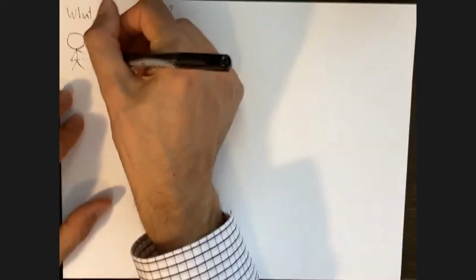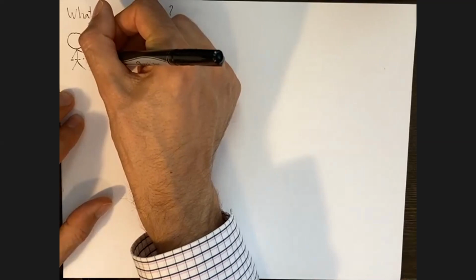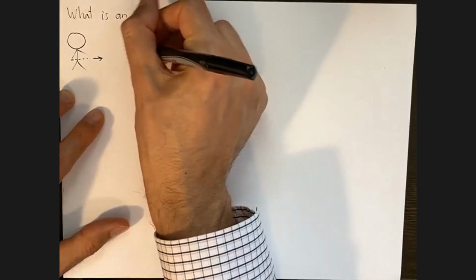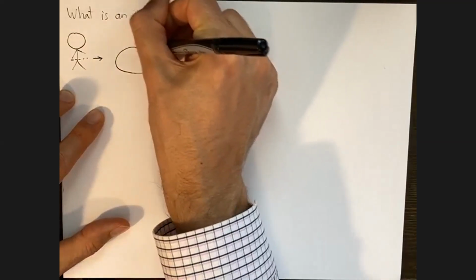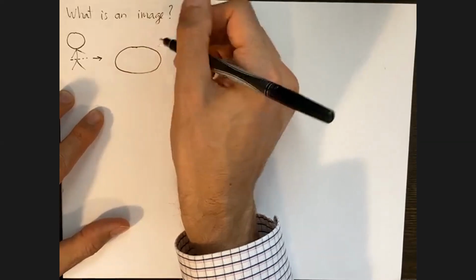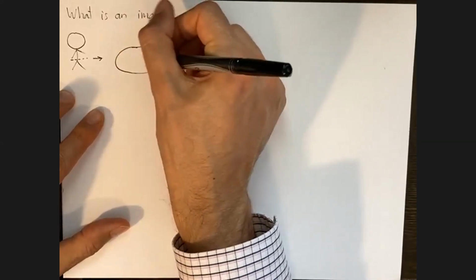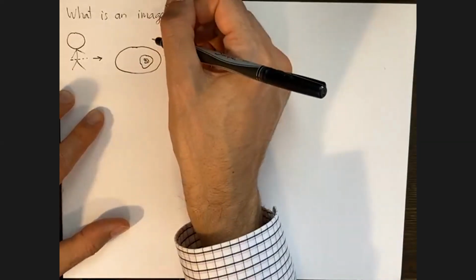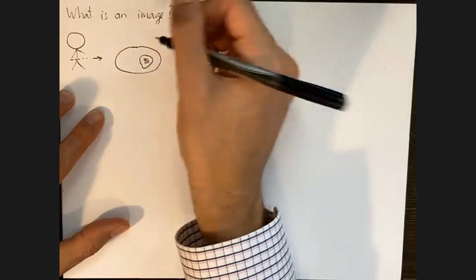And this is going to be mathematically represented as a function of 2 variables. So if I try to draw the distribution of the tracer across this cross section, it's going to look like this. This is the abdomen of the patient, and maybe there's a region of the abdomen where the tracer has accumulated more intensely because of an underlying medical condition, for example.